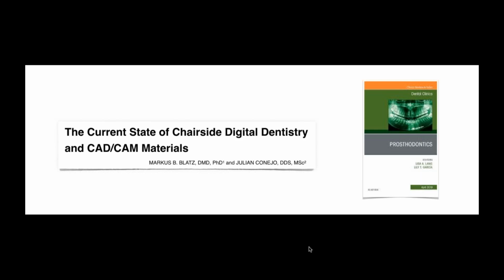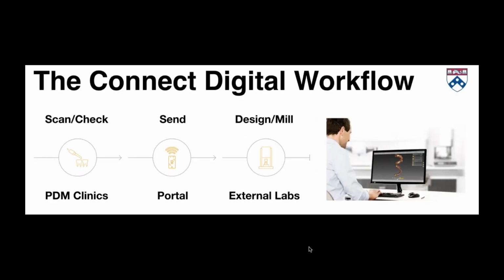So we have this chapter talking about the current state of chairside digital dentistry and materials. And today I want to focus on some of the materials, not so much on the chairside approach, but more on what we call the Connect workflow. And this is the workflow that we use for these high aesthetic clinical situations, maybe more demanding patients. Many times we're remaking dentistry and we've got to make sure that this result is better than what the patient had in their first experience.